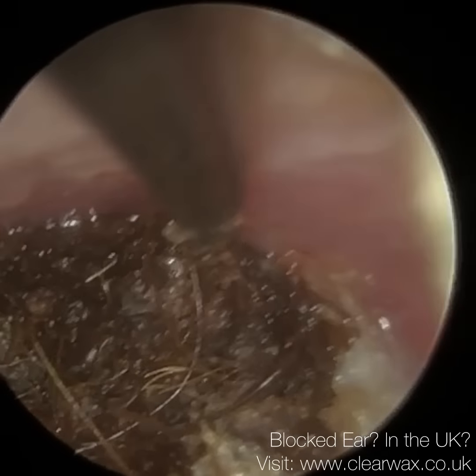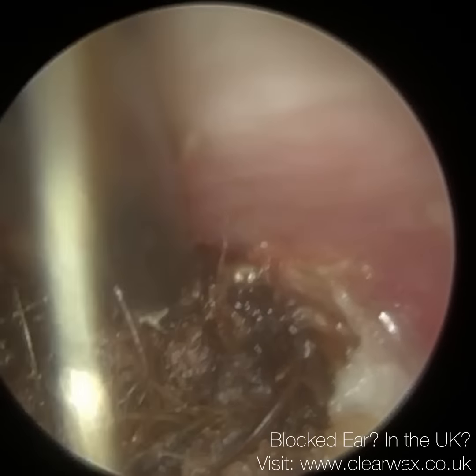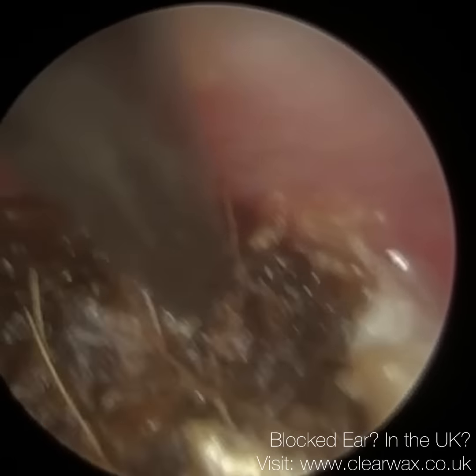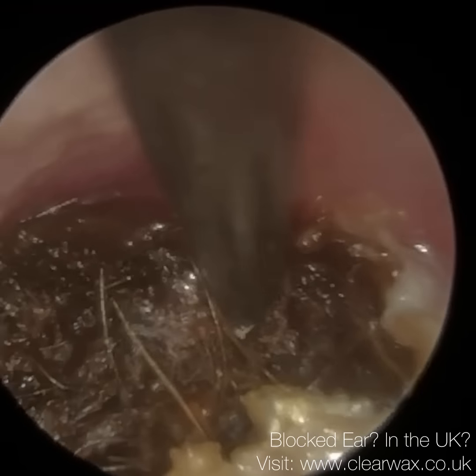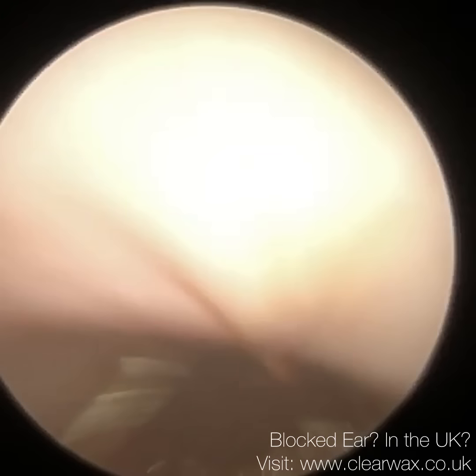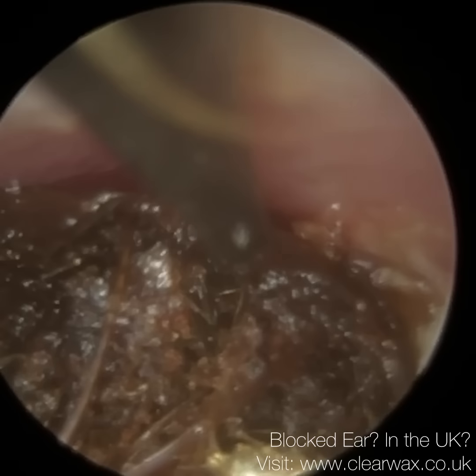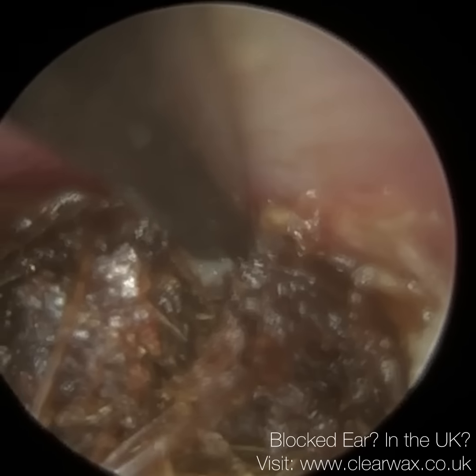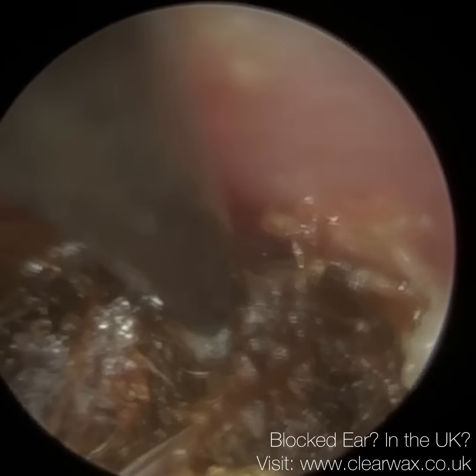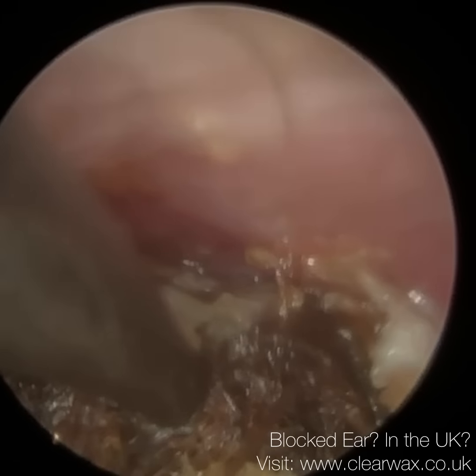So we're about 10 minutes in, and visually it looks like we haven't done much. We have removed quite a lot already, but it's just bringing back. So I've just gone back in now with the ear pick. I'm really just trying to lift this off the back of the ear canal. And this is why I developed the ear pick. The ear pick was primarily for keratosis obturans. I'm able to glide in a lot better.